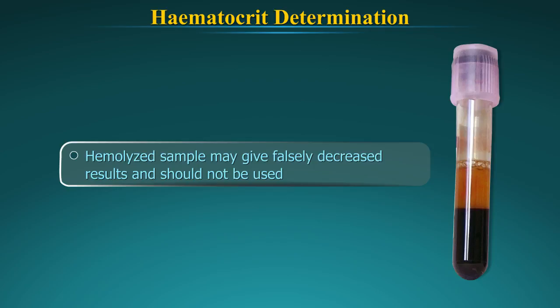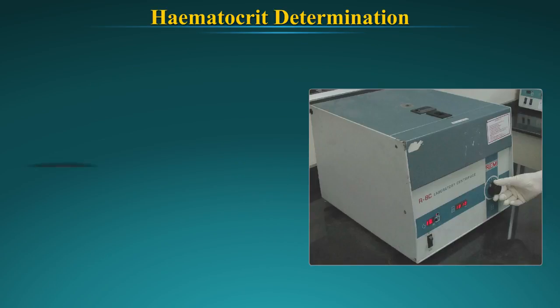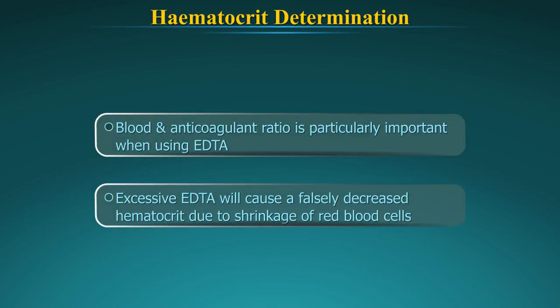Sources of error: Hemolyzed samples may give falsely decreased results and should not be used. Blood must be well mixed and should be at room temperature before testing. The time and speed of centrifugation are important factors in obtaining maximum packing of the red cells. Inadequate centrifugation will result in falsely elevated results due to excessive trapped plasma. The blood-to-anticoagulant ratio is particularly important, especially when using EDTA. Excessive EDTA will cause a falsely decreased hematocrit due to shrinkage of the red blood cells.